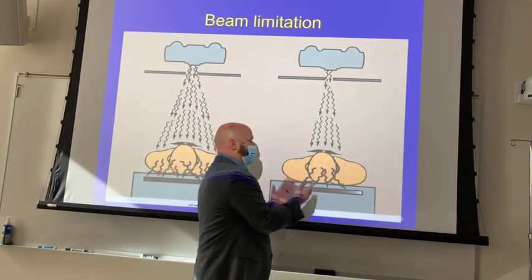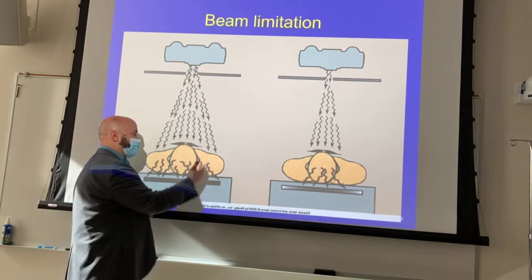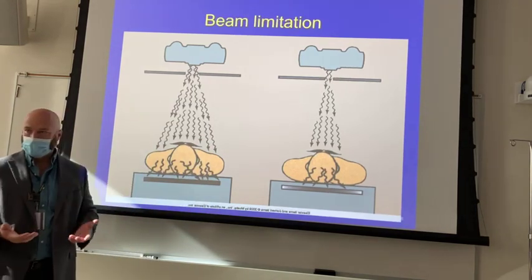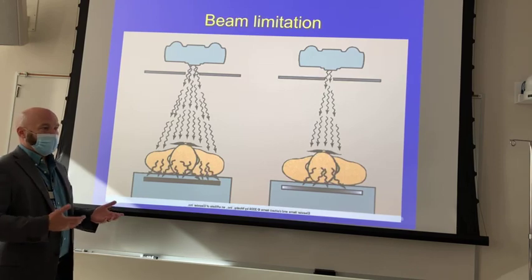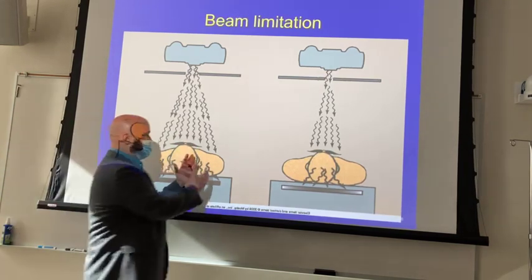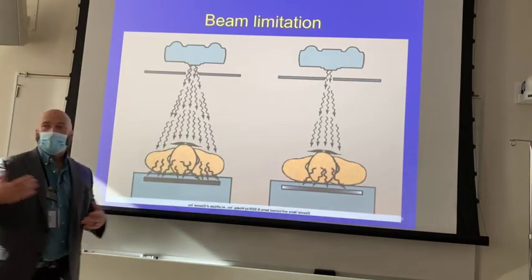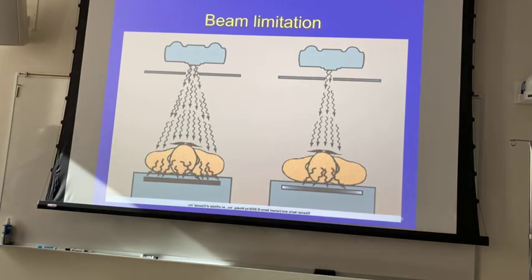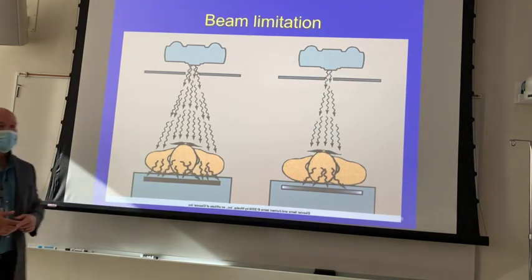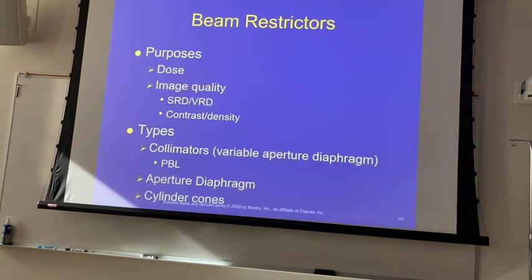But as we narrow it down, we're creating less penetration, we're creating fewer scatter photons, and even lower patient dose, because photoelectrics that would be occurring out here aren't occurring in this one, okay? So we're going to get fewer interactions with all three primary types of interactions with increased collimation. So field size gets smaller, we get fewer interactions.